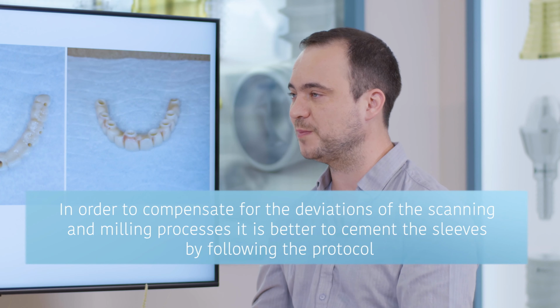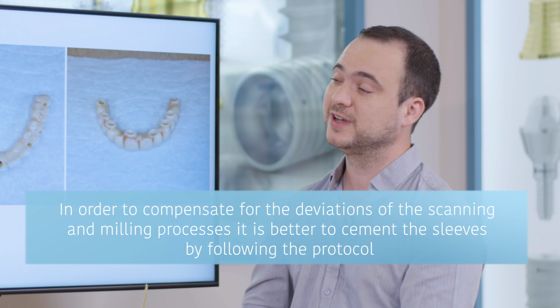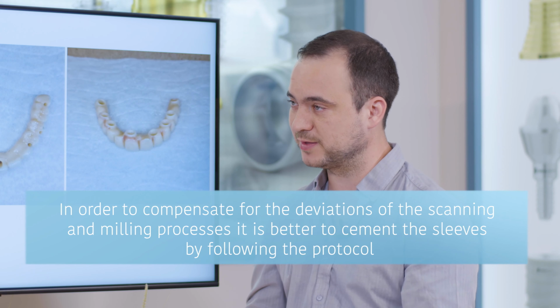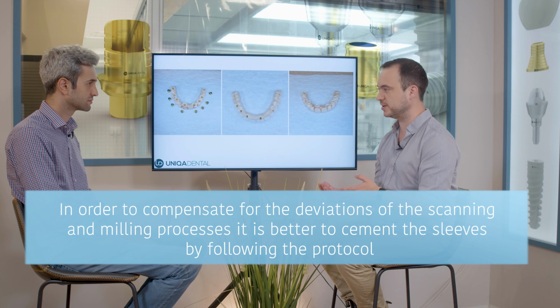We want to compensate for the inaccuracies, first of all, that you have when you sinter the zirconia. You mill the zirconia from unsintered material, and then you sinter it to a much harder material that shrinks and has some deformations in the sintering process. So you want to compensate for those. You want to compensate maybe for some inaccuracies from the scanning process. So this way we compensate those inaccuracies in the process of the cementation of the sleeves.